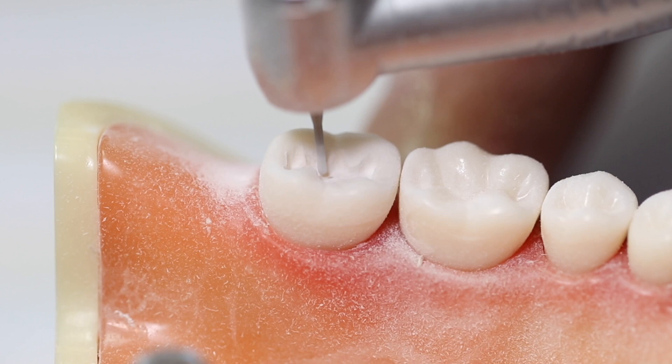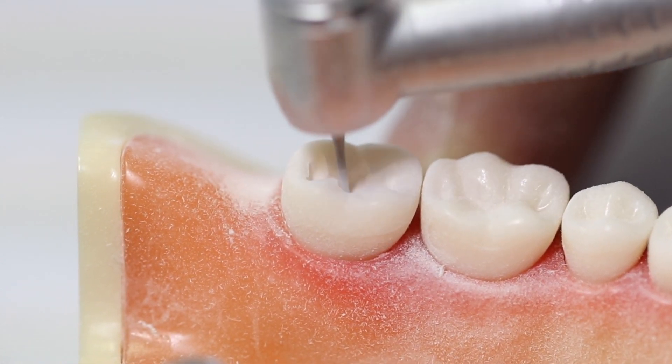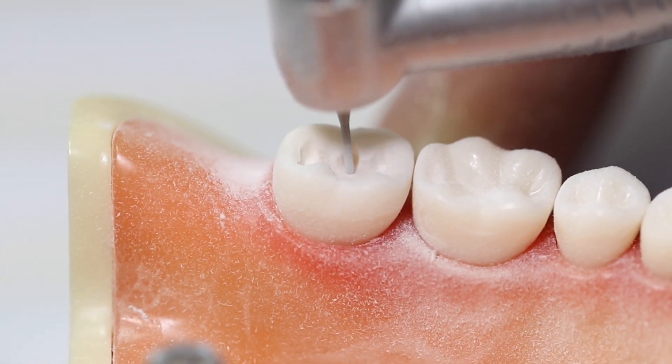Pay attention to the position of the handpiece. Keep the burr in the same plane. Try not to wobble the handpiece and burr side to side or up and down.